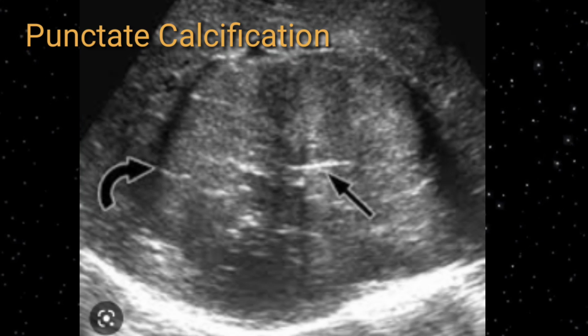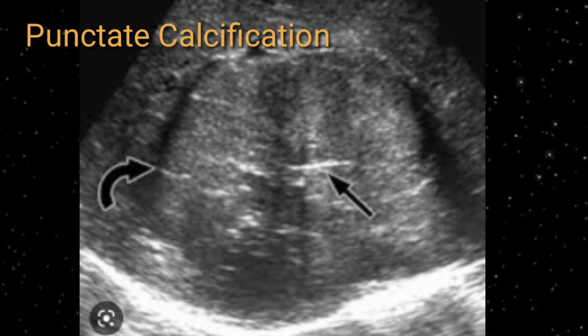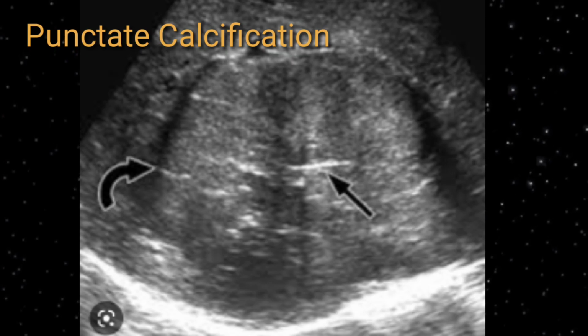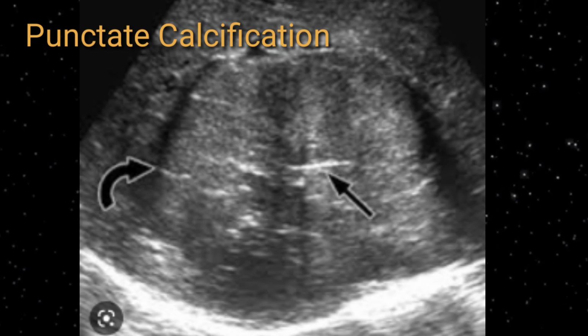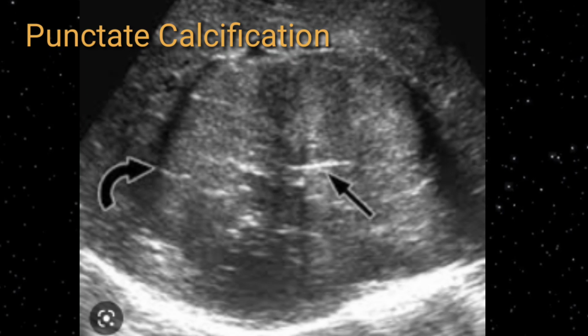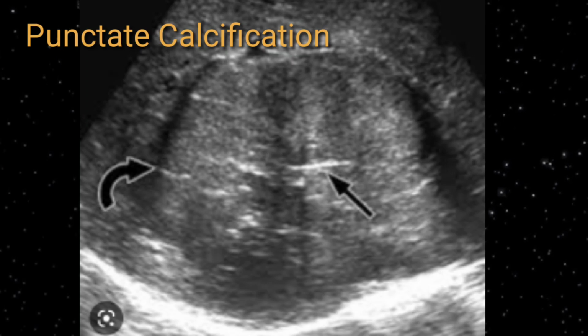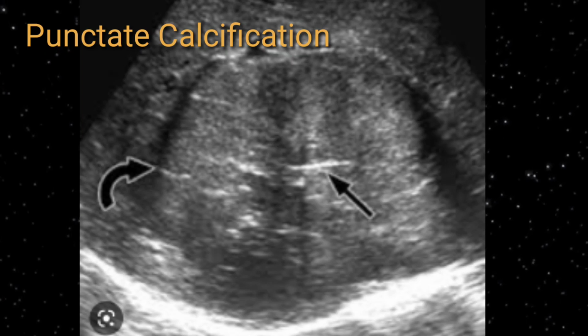The echogenicity of the liver is normal. No previous liver pathological process is seen in this liver. A large predominantly hypoechoic solid mass of the liver is visible. You can appreciate in this image that there is punctate and linear calcification within the tumor. However, the central scar is not clearly visible on this image.